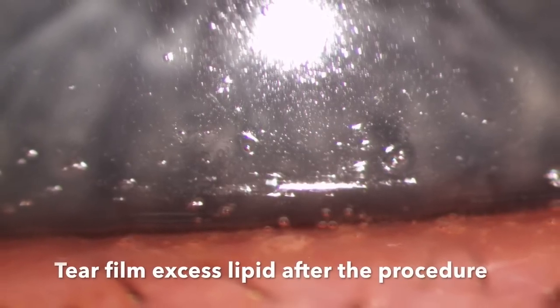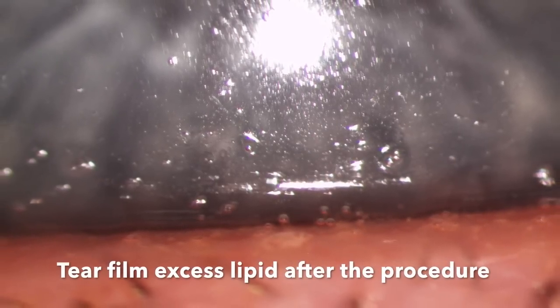Depending on how much you express, you also get the presence of excess lipids in the tear film after the procedure.